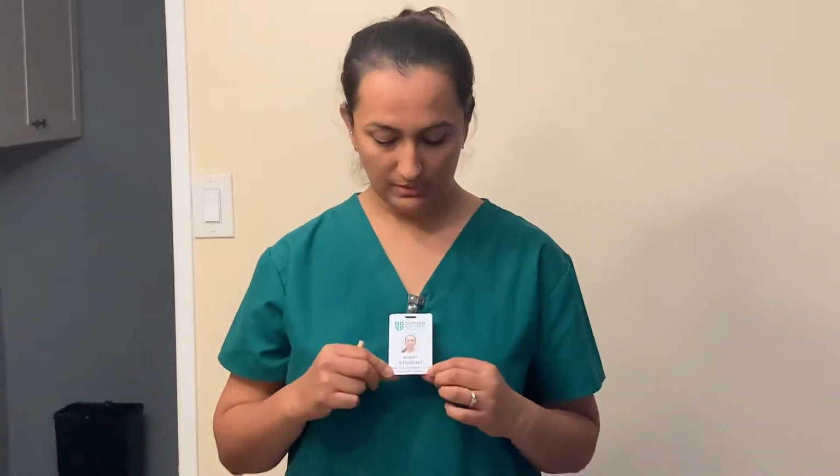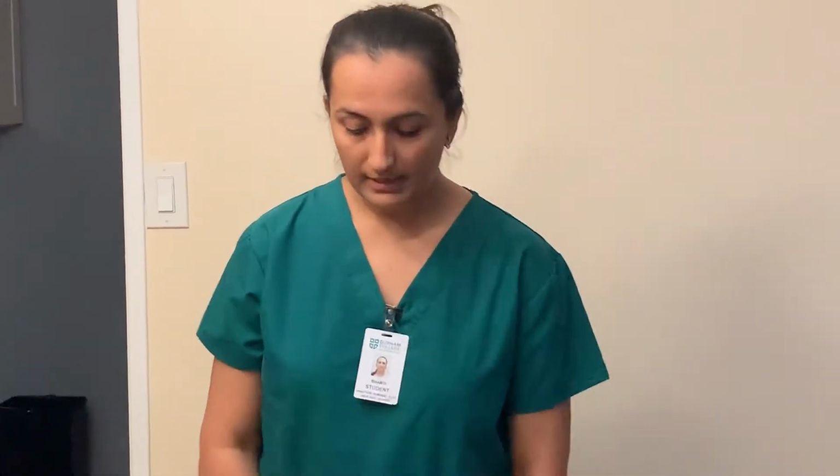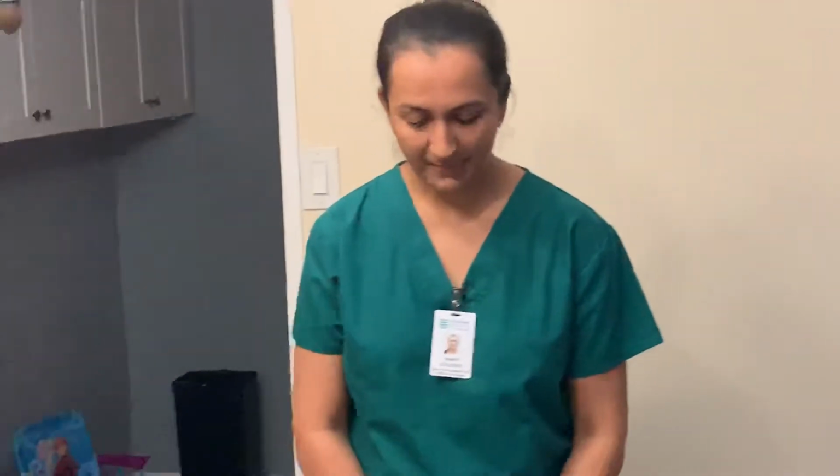I am a practical nursing Durham College student, semester 2. We are doing a midterm critique for a simple dressing with sterile gloves. My student ID number is 100762282, and let's get started. So first of all, we'll check the doctor's orders.